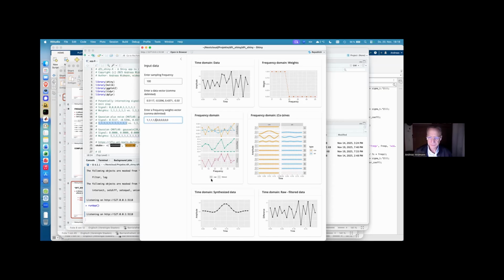And we recover our signal. You see that the magnitude response in the range where our weights are 0 is then, of course, also 0. That's not the case for the phase response, but that's mainly due to rounding errors. So you should not be bothered by that for the moment. So the good part, we can recover signals if signal and noise bands are separate to some extent.